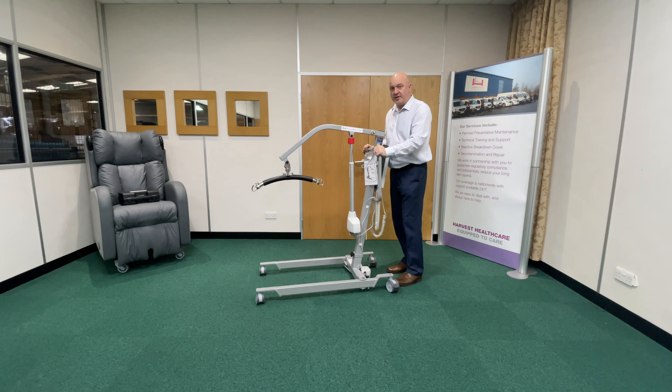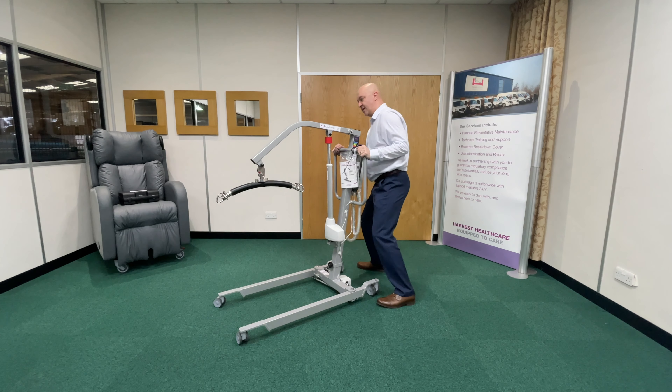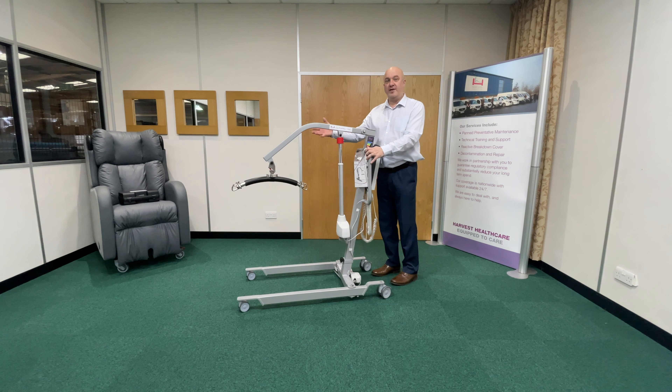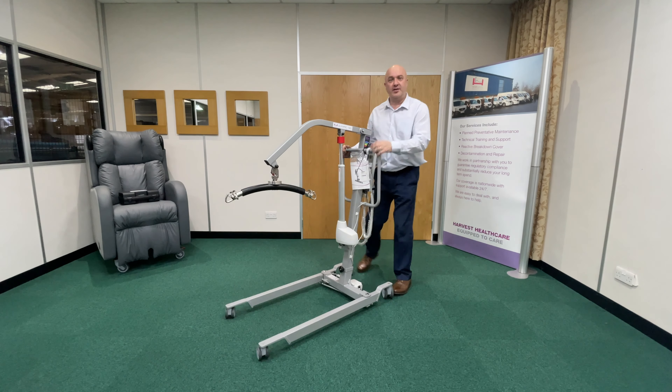The biggest cause of injury to care staff with the hoist is turning. If I turn to the left or turn to the right, there's a lot of twisting motion going on in my spine to physically move that hoist. Obviously I'm exaggerating that, but if I was on a thicker carpet with a heavier person, that would be realistic — trying to get that hoist to turn around and face the direction I want to go.